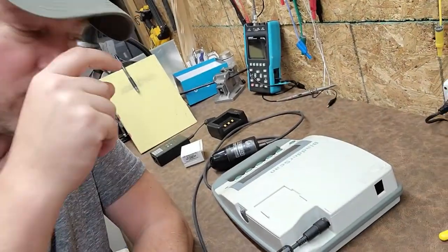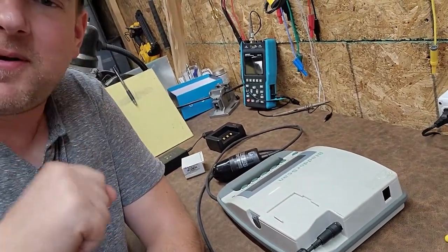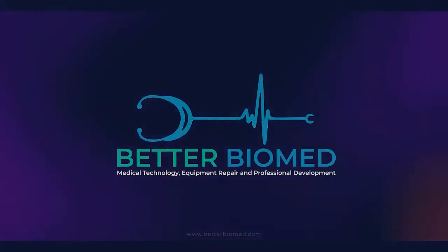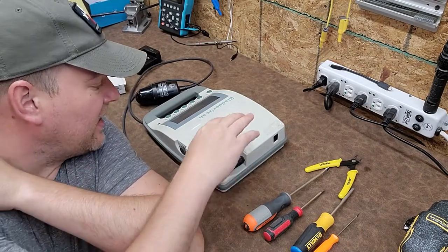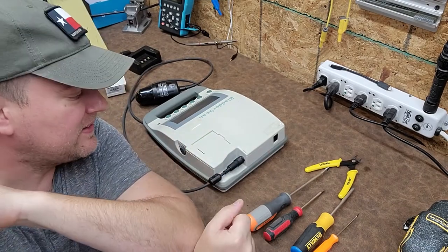Today is the day we're going to tear this guy down and see exactly what makes it tick — the Verathon bladder scanner, coming up next right here on Better Biomed. Welcome back everybody, today is the day that I finally made some time where we are going to tear into this Verathon bladder scanner and see exactly what it is that makes this guy tick.